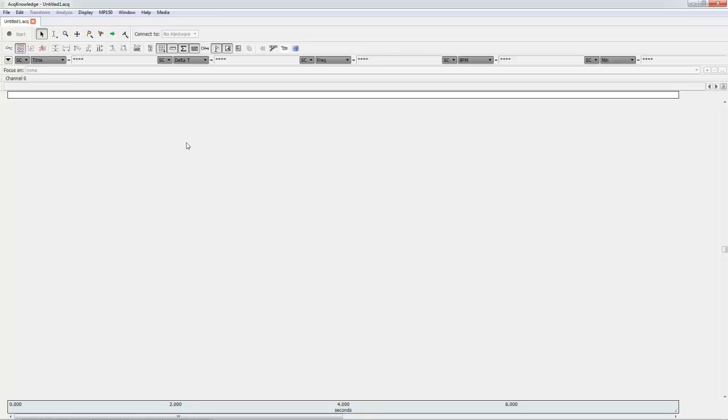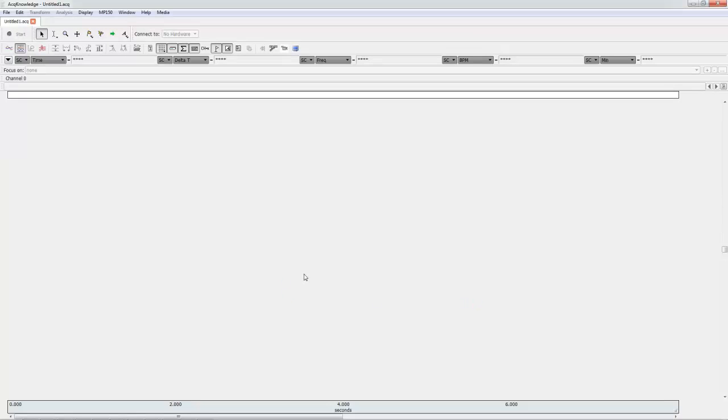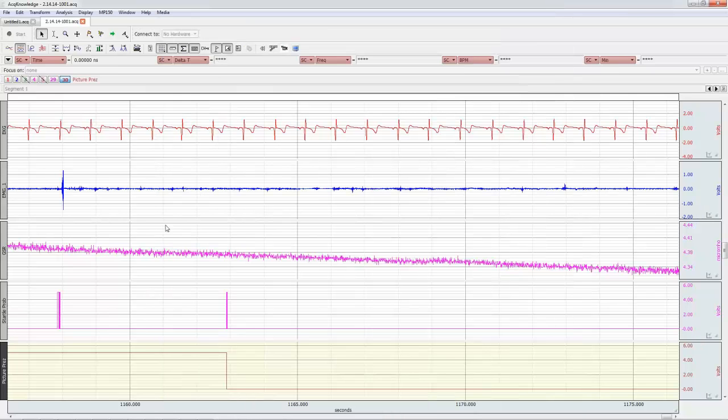Okay, this is a video on how to process EMG Startle data for data analysis. So first thing we're going to do, we're going to open up our raw file, and you'll notice, we can just close this video that pops up, you'll notice that we have EKG and GSR showing. We're not working with those right now, so we can actually just hide them.